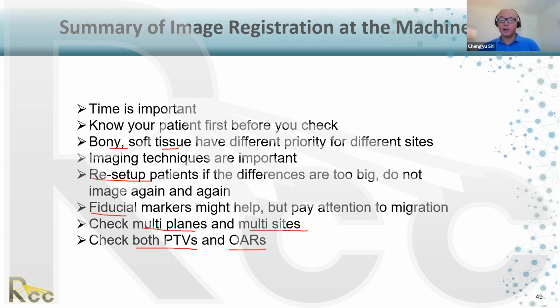Fusion is after you do image registration, you merge these two modalities together, giving you the visual view of both, like the PET function on the CT, and the MRI function on the CT, or another CT, like a diagnostic CT contrast on your planning CT. So that gives you mutual information to help you contour or make a decision. Does it make sense?